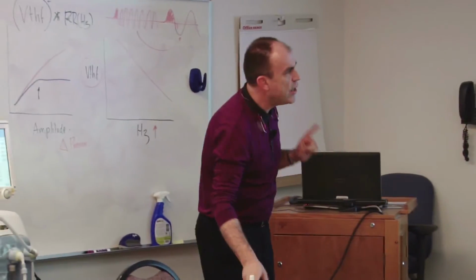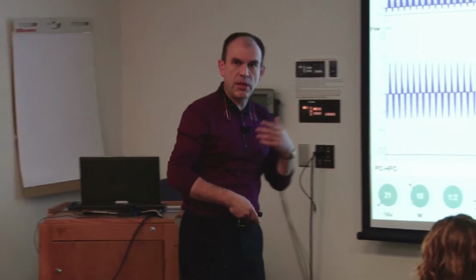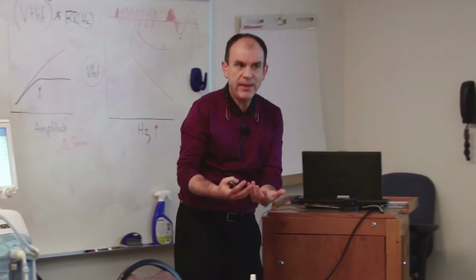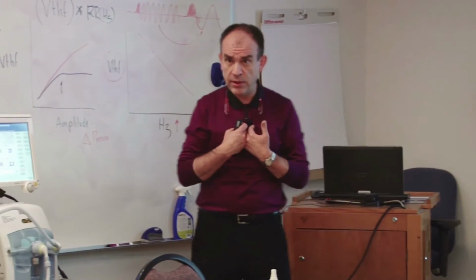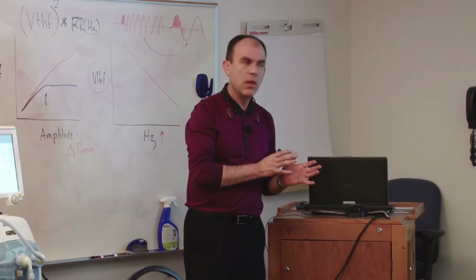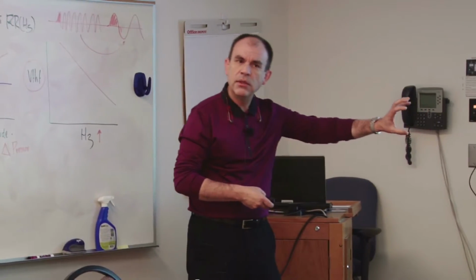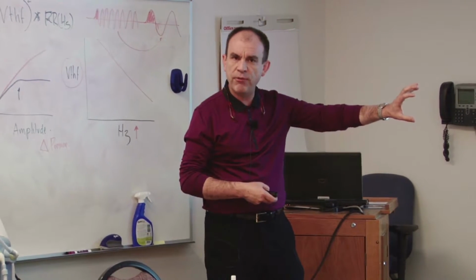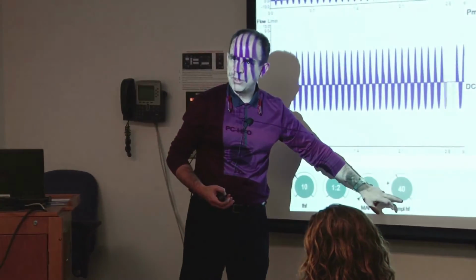Once we arrive at a VTHF, and I understand the protocol you're about to begin suggests this, a VTHF which correlates with a PCO2 that we feel comfortable with, then we can switch to a different mode, which means saying, okay, now I want to hold on that VTHF and let the ventilator handle the amplitude.